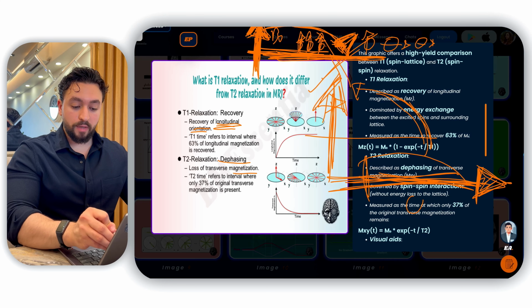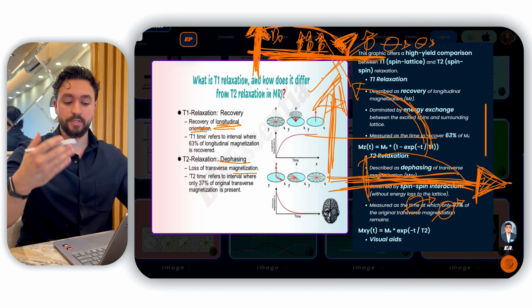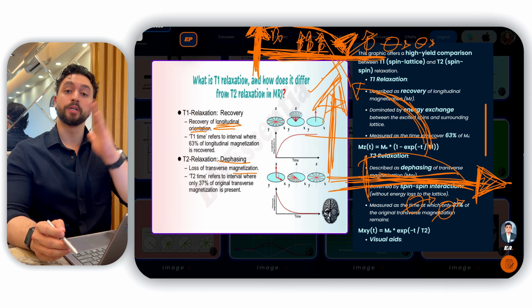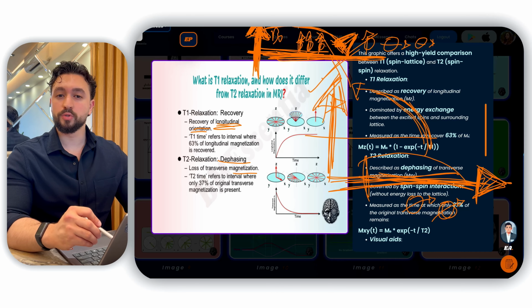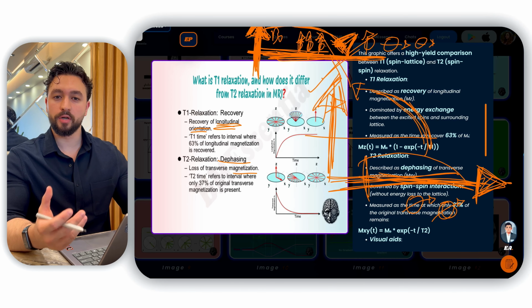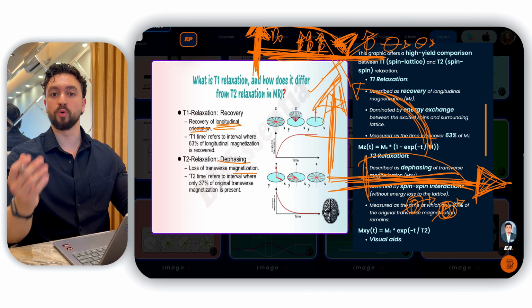Well, we said because now the protons have all been homogeneous, in alignment, in phase, and all spinning at the same speed. When we cut the RF pulse, firstly, recovery of the original position happens, which is T1, and then secondly, all of these proton spins will experience varieties within the speed, and they will all start dephasing. So every single one of these protons will now spin randomly at random speeds because there is no RF pulse.